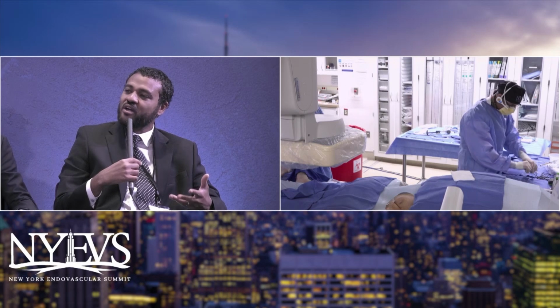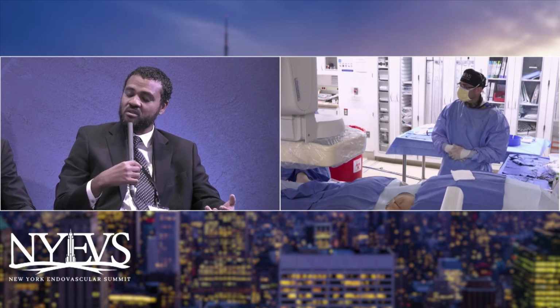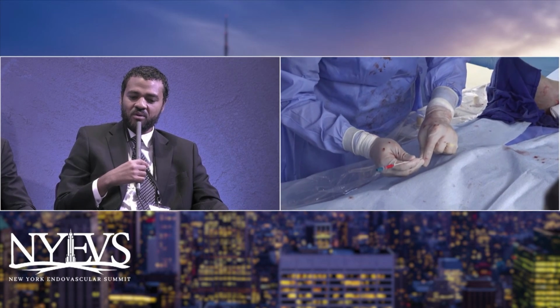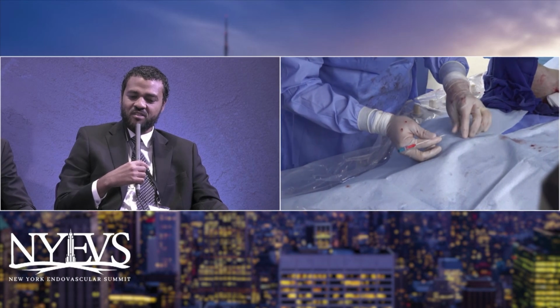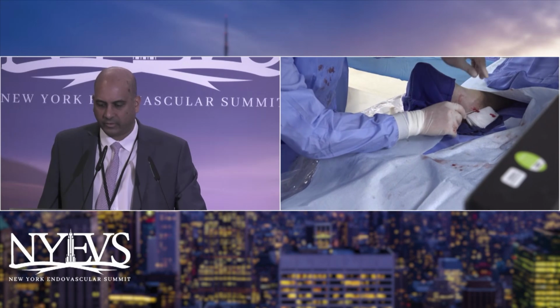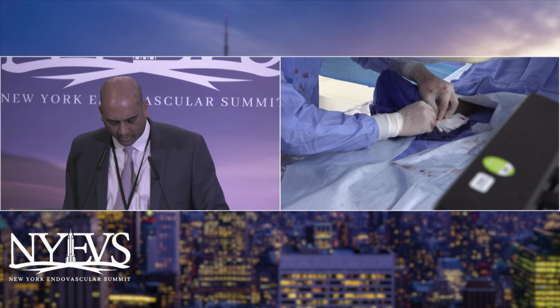Because again, you aren't actually fixing the lesion. Then you've got incisions that are there. It doesn't stay open very long. You've got those incisions that end up not healing as well. So this is a great choice. I agree with Steve wholeheartedly that I would attack this from an endovascular standpoint first. Yeah. So Steve, what's your plan right now? Just kind of talk us through what your thought process is, if you don't mind.